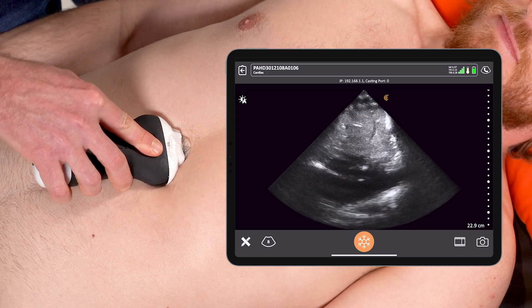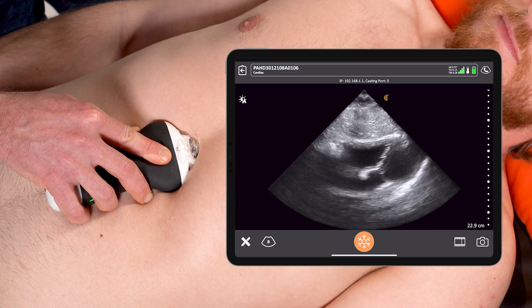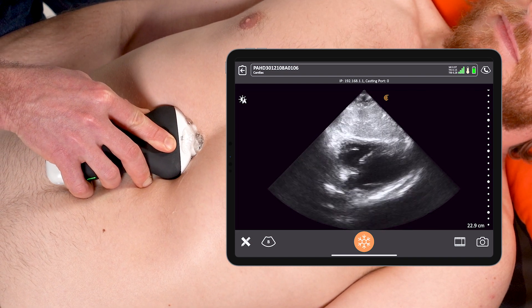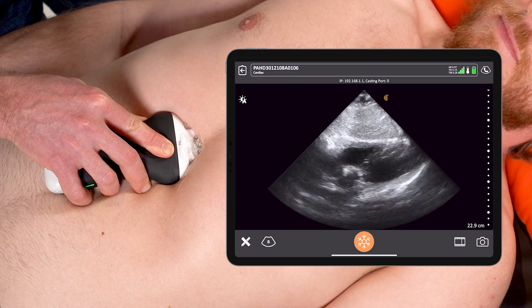To do the scan, I place the probe below the xiphoid process, generally aiming up towards the patient's left shoulder, and a bit of gentle pressure is required while keeping the probe parallel to the floor.